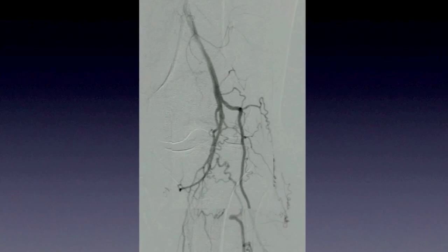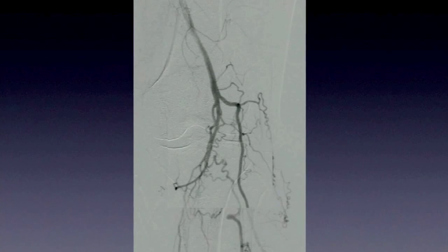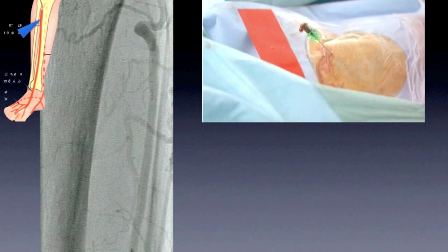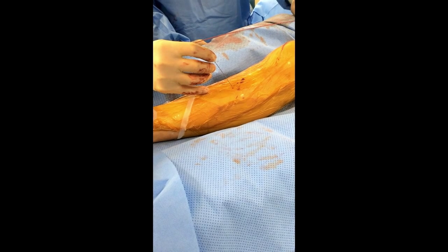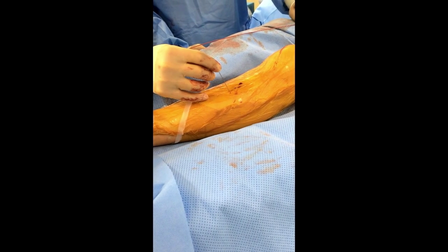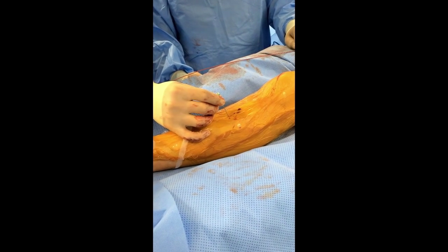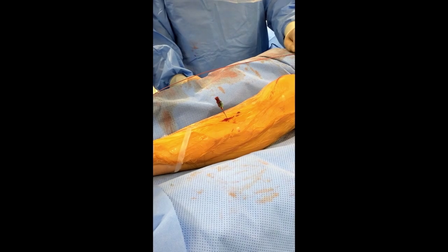This is a great case where you could see the complexity of the collaterals that would never allow the wire to go from the top to the bottom in an easy fashion. Once we decided that this was a good case for an anterior retrograde approach, it was accessed high above near the patella. So you first go through the skin, and using diagnostic angio, you could pretty much align the needle to the artery. Then slowly, a millimeter at a time, you direct downwards until you get, through a micropuncture needle, that little brisk flow.